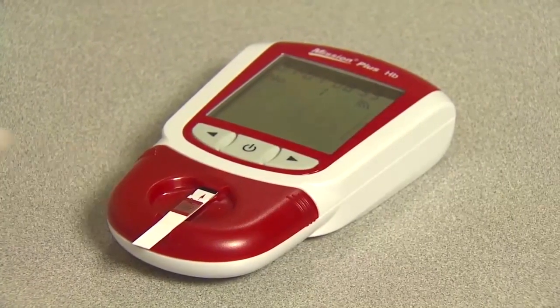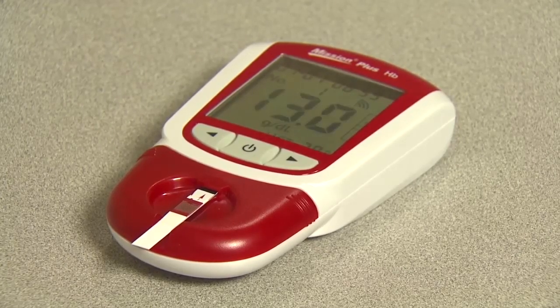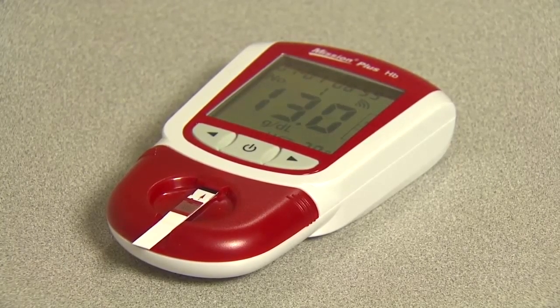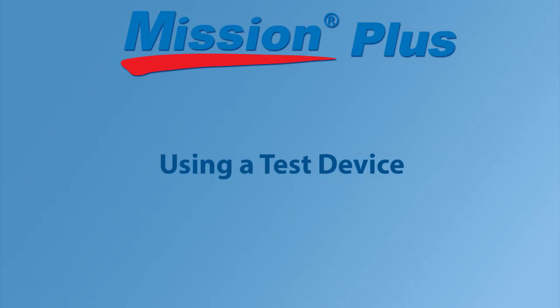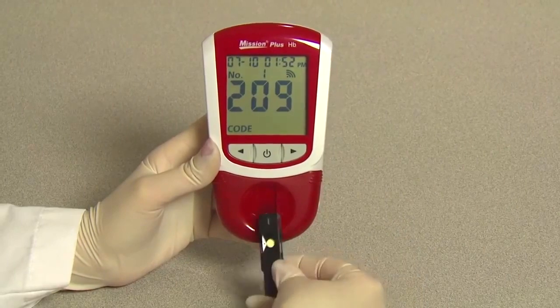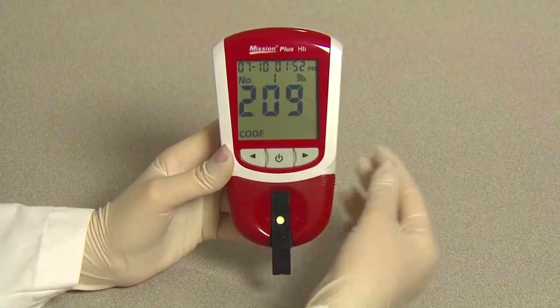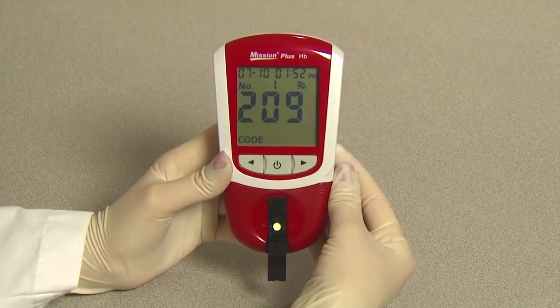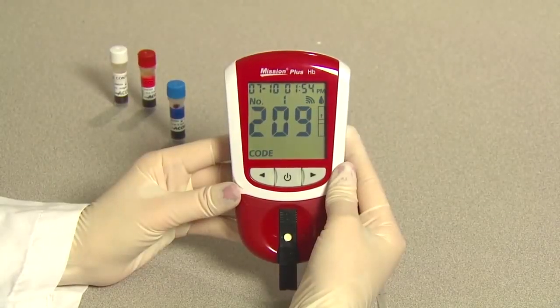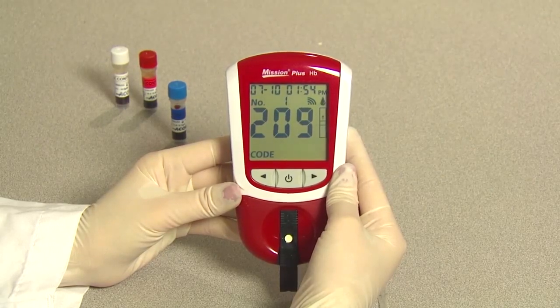3 dashes will appear on the meter to show the test is in progress. Read the results on the screen after 15 seconds. Using a test device, wait for the meter to flash the test device symbol. Insert the test device completely into the test device channel in the same direction as the arrows printed on the test device. The blood drop symbol will flash when the meter is ready for the specimen to be applied.